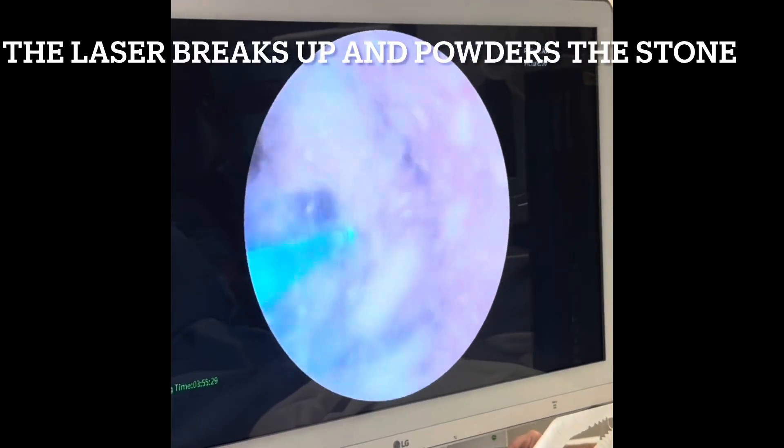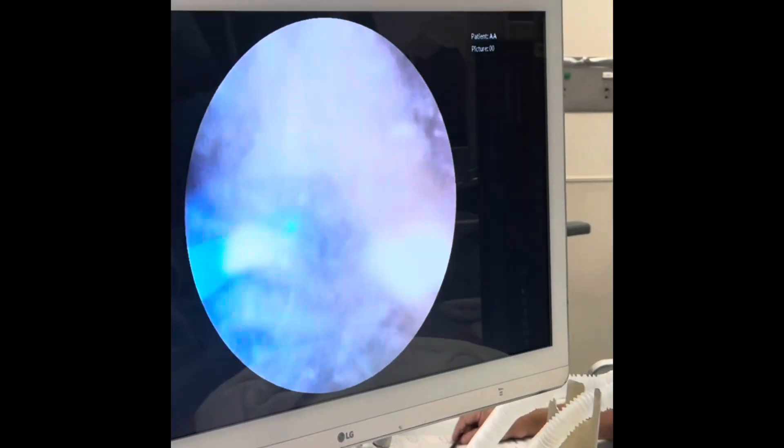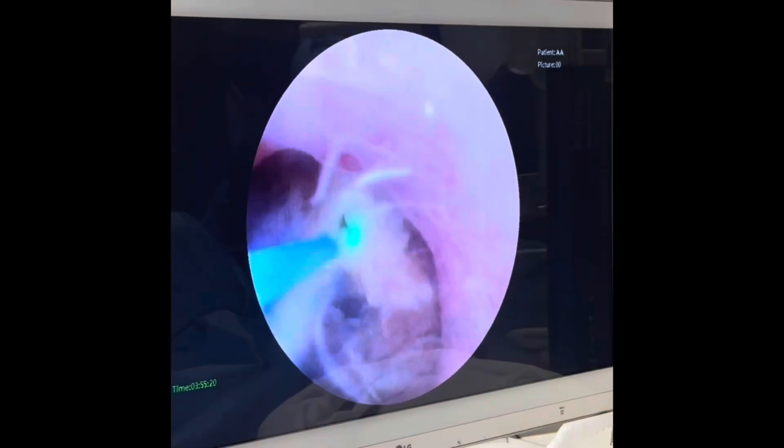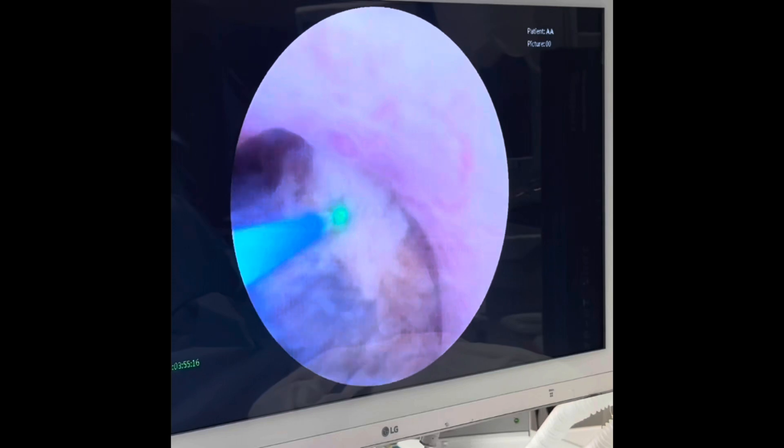This is a very large stone. Prior to the Thulium laser, we would have done a percutaneous surgery for this. But now, hopefully, we'll be able to break up this stone into very small pieces.